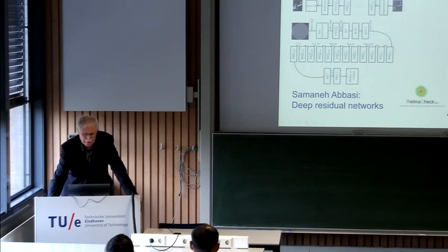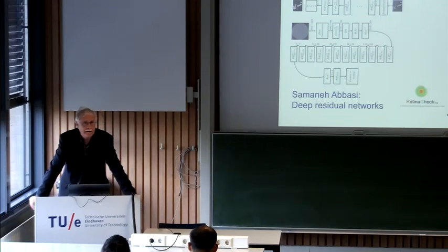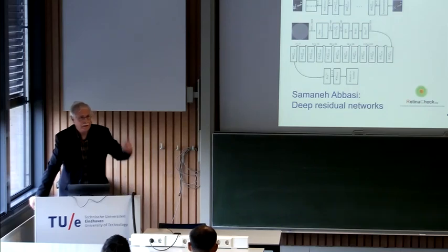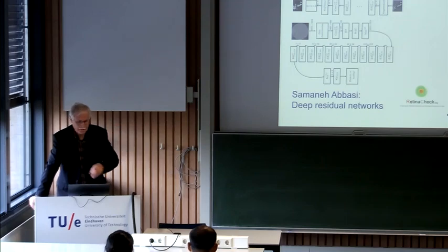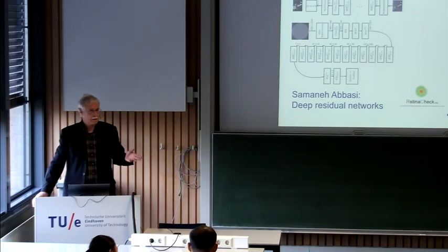We train them with the data sets that are now available on the internet. One data set, if you want to play and go around with a huge number of data, I talked about the Kaggle challenge. Kaggle was this Californian company. You have 90,000 images from the retina, fully classified, right there. And in the end, I'll show you some examples. It's only 180 gigabytes. You download it, and you have a lot of data to play with. So that's the recommendation. It's fantastic, nice material to have a look.